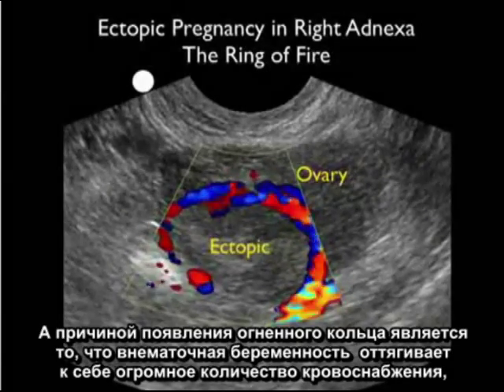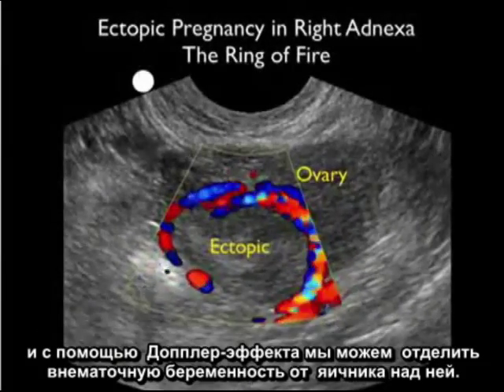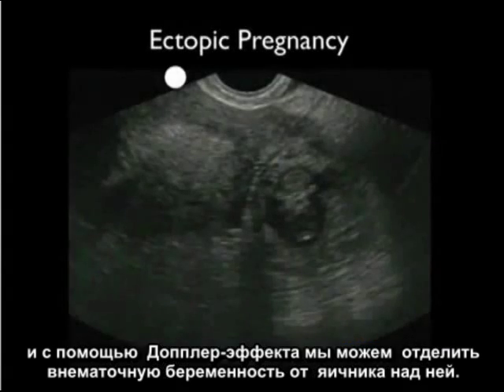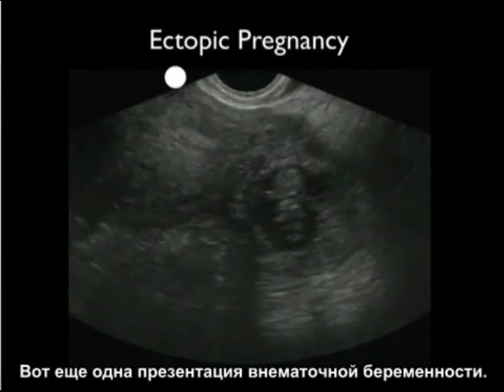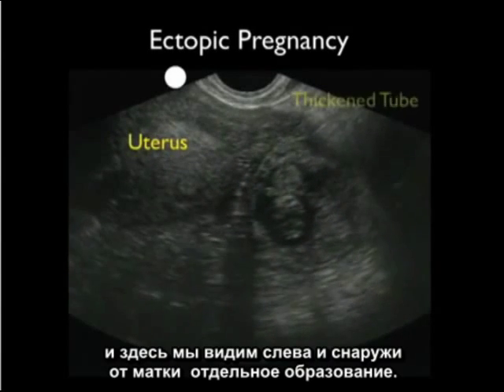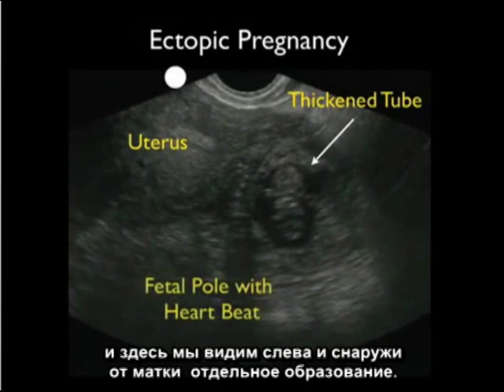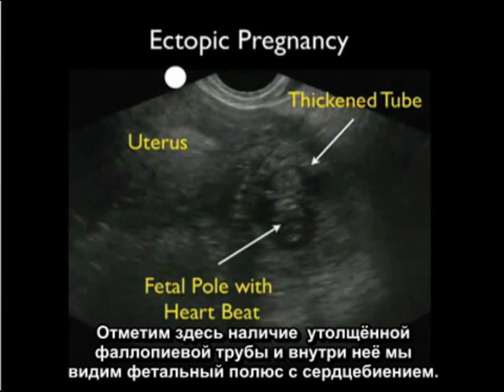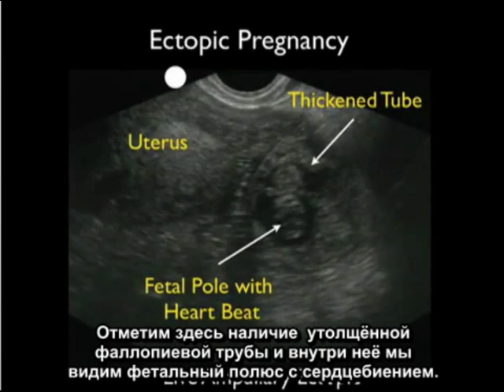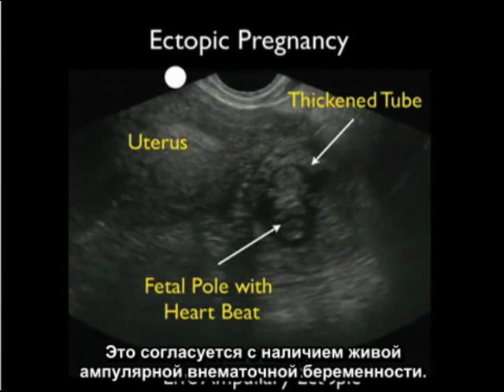The reason for the ring of fire is that the ectopic pregnancy pulls a large amount of vascularity towards it, and using Doppler we can separate the ectopic from the ovary above it. Here's another presentation of an ectopic pregnancy. Scanning in a short-axis plane, we see the uterus to the left and outside the uterus a separate structure. We note the presence of a thickened fallopian tube, and inside it we see a fetal pole with a heartbeat, consistent with a live ampullary ectopic pregnancy.